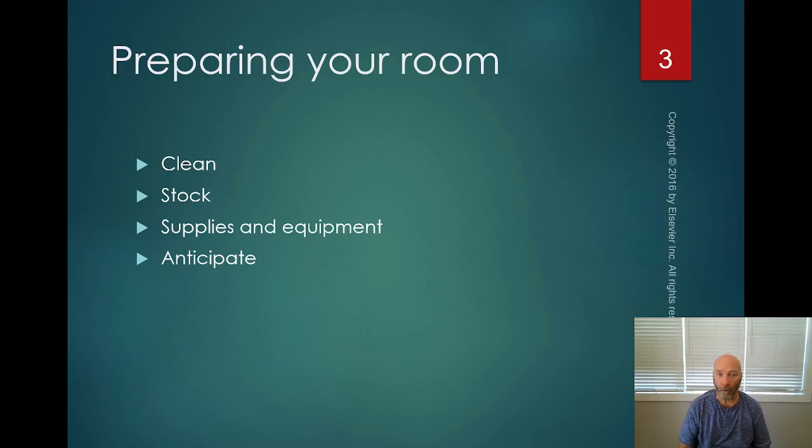But what you always need to do is make sure that your room is clean. At the start of every working day, you need to get in the habit of cleaning your room. That's rubbing everything down. I'm not going to say that the people on the shift before you might not have done their job, but night crews tend to run a skeleton crew, and sometimes they don't get around to cleaning things up as well as you would like them to. So before your first patient comes in, the first thing that you need to do is clean your room up.